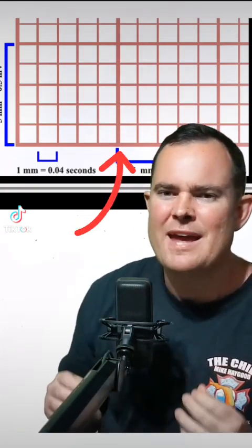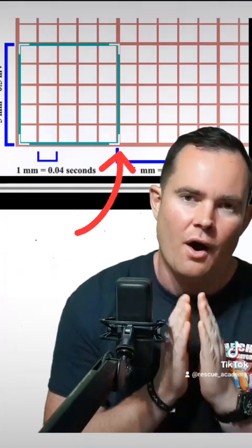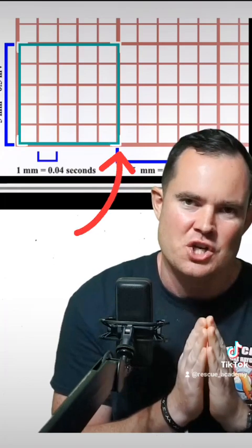And what I mean by paying attention to large boxes, I want you to pay attention to the QRS or that R wave whenever it is touching a large box. Let's take a look. So right here, I can see that I have a R wave that is touching a large box, right? It's right on the dark line.